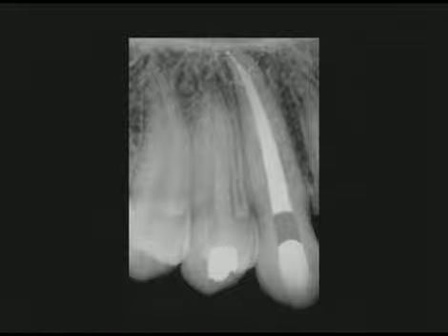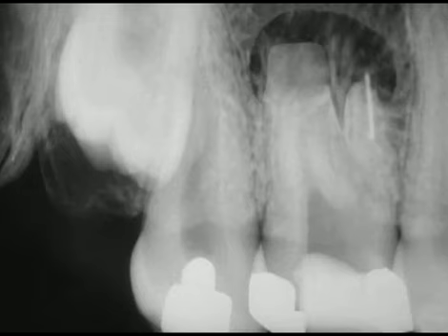Note the densely packed system and the 3 apical portals of exit. Here's a challenging case. A distal oblique angled preoperative film of a previously endodontically treated and surgerized first molar. Note the previous access. A broken instrument off-centered in the root. Apisected roots and a possible MB2 system.